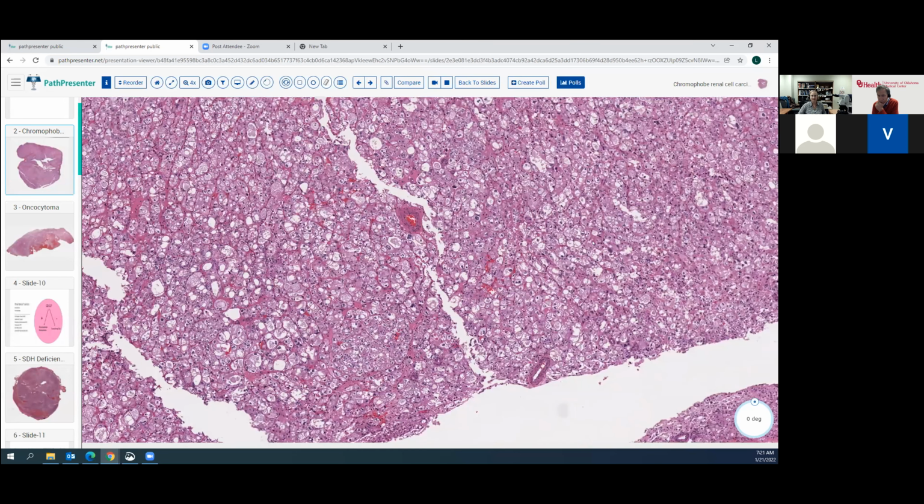High-grade oncocytic tumor, low-grade oncocytic tumor, I would assume. Okay. Those are more entities that I would use to describe like a wastebasket diagnosis.